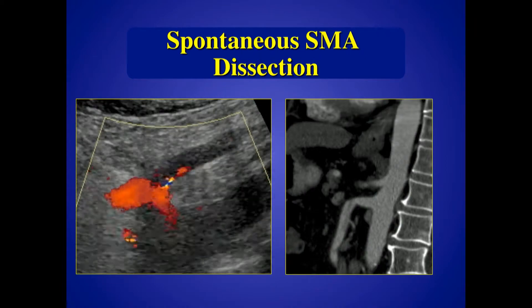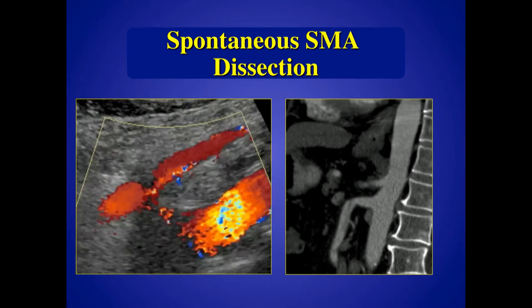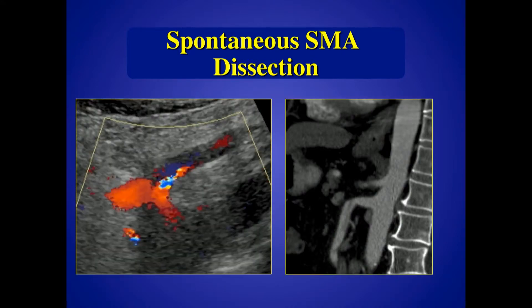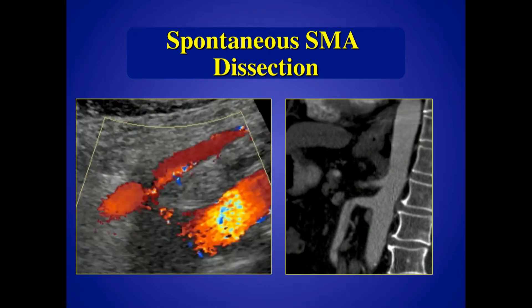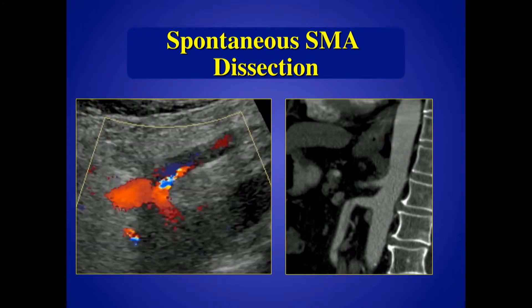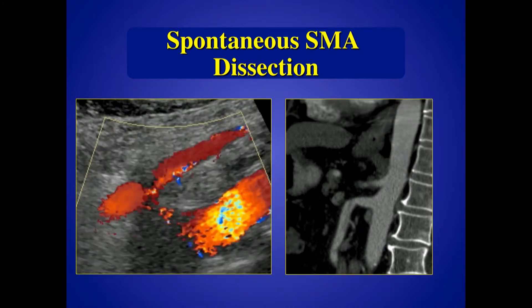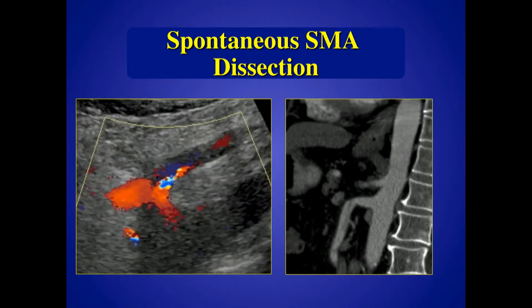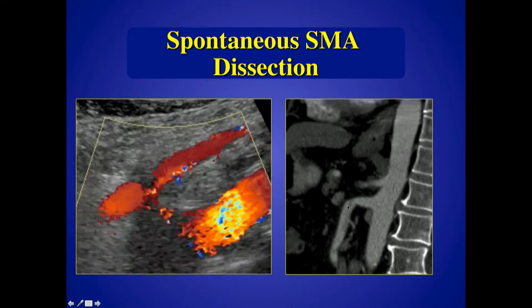Sometimes you'll just pick up another abnormality. Here's a case of a dissection — most of them are incidentally picked up. Some have had a dissection known on a prior CT scan, usually an extension of a thoracic dissection that's moved into the abdomen. Here you can clearly see a dissection — the best way to see it is to turn the color off and see the flap. But with the color on you can see the double lumen and the delayed fill-in of the false lumen in diastole. Here you can see it pretty well on the CT scan.